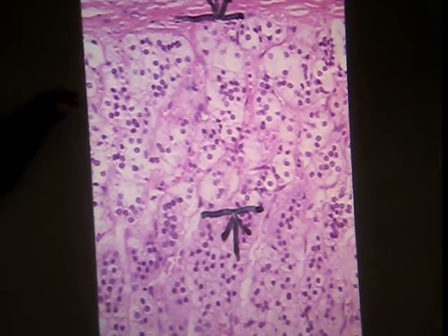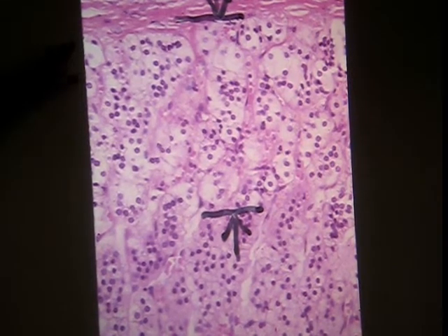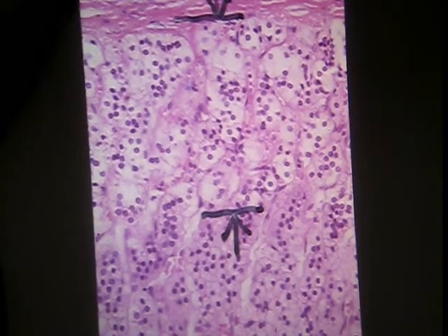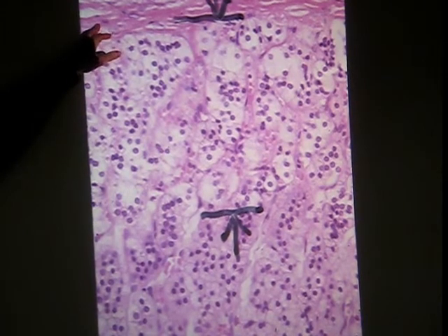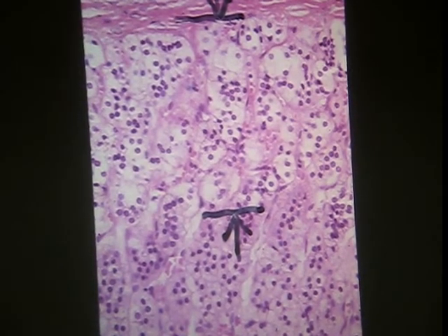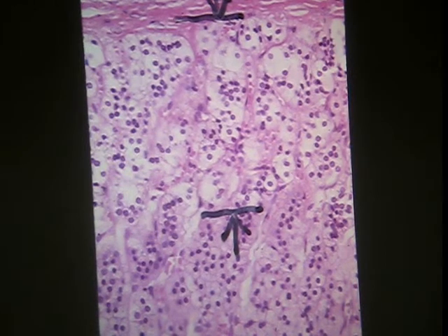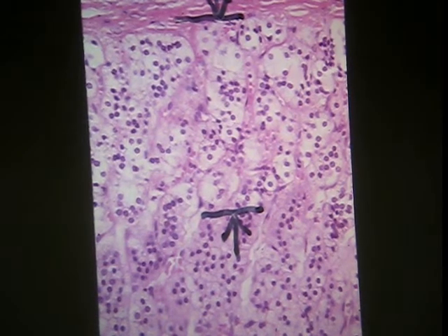So this is a high power shot of the adrenal cortex. What's this right here? What does it look like? Well, what do you see? We've got a lot of eosinophilic staining tissue. What's the nuclear density? Very high. Is it low?